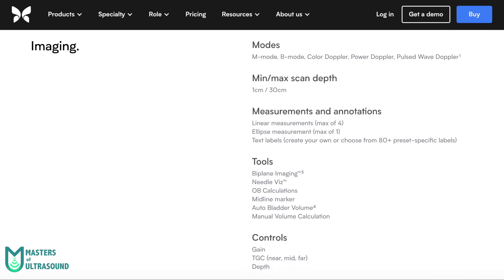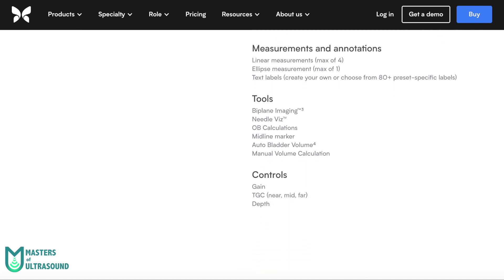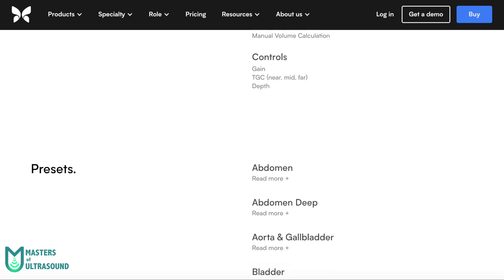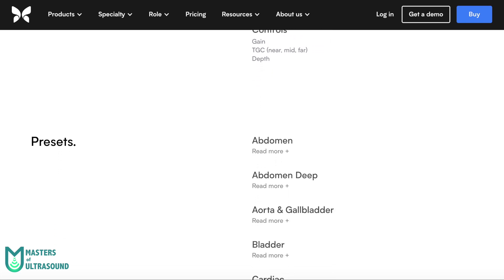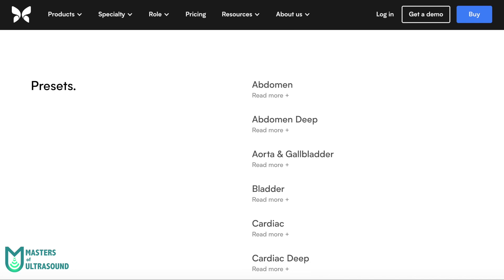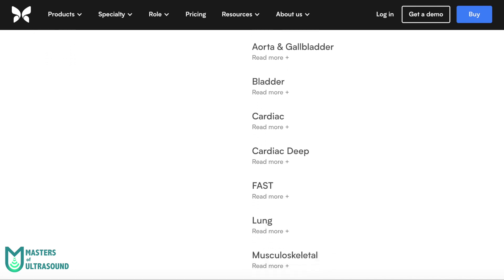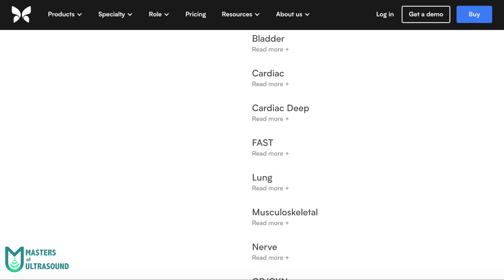It has some amazing software tools to calculate the left ventricular ejection fraction, bladder volume, obstetric calculations, and more. Another tool worth mentioning is the Needle Viz mode, which displays the longitudinal and transverse axis at the same time to allow simultaneous in-plane and out-of-plane approaches.